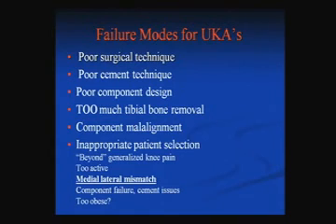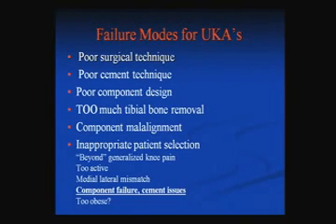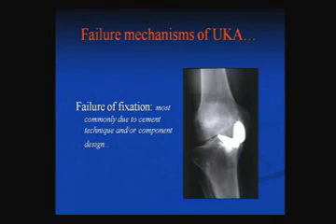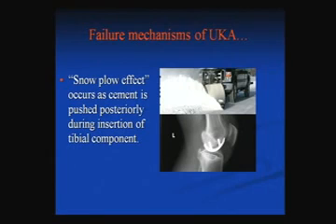Medial lateral mismatch is another problem with some of the designs, and you can see this one here. This is obviously not going to do well. And what about component failure and cement issues? Again, fixation failure is most commonly due to inappropriate cement technique and/or component design. Some of these old component failures with oxidation and non-cross-linking of the poly were also an issue.